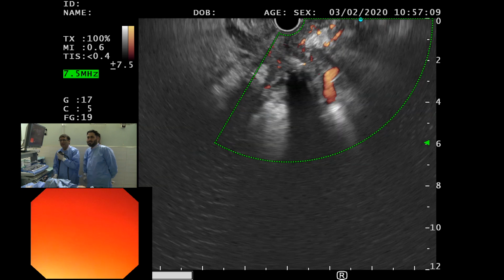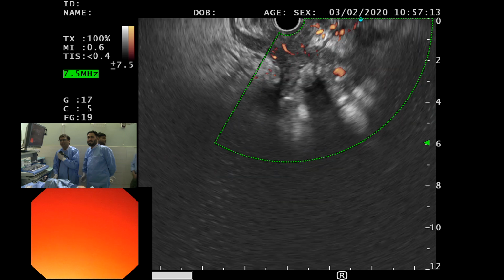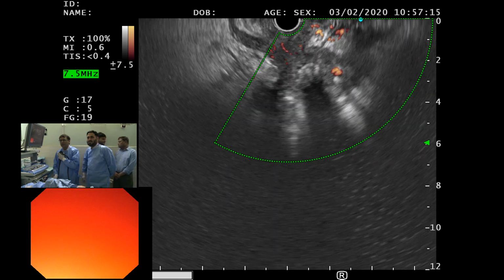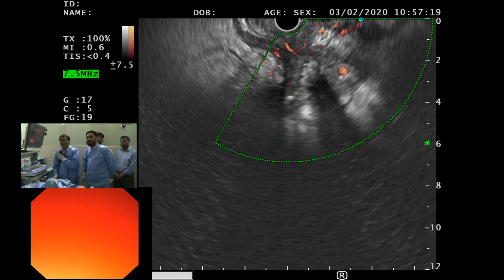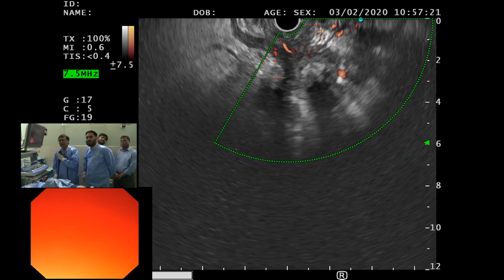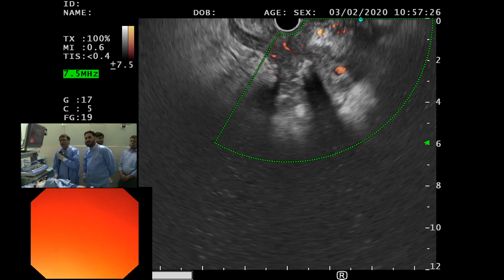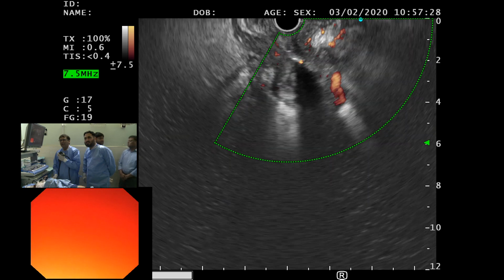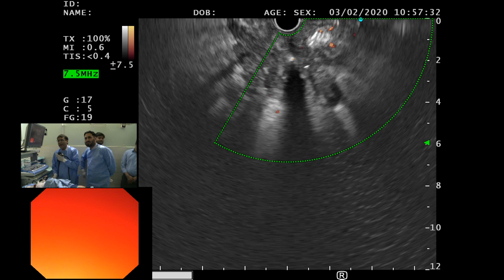Right above, you see in certain areas, right above the echogenic area, right where the echogenic area is, where it starts from the top, that's a part of the duct, and it's going to the right now, going to the left, right above that, but then I lose it, it kind of ends up into this anechoic area.